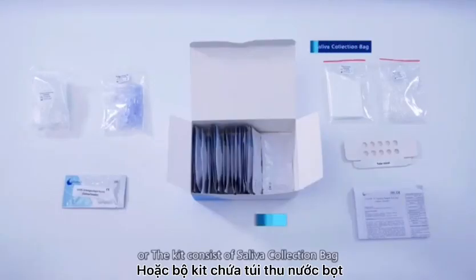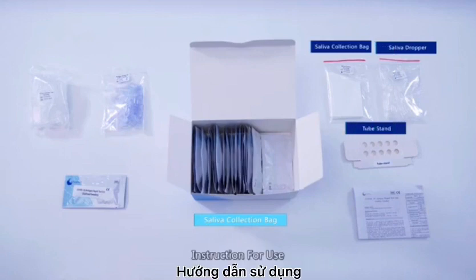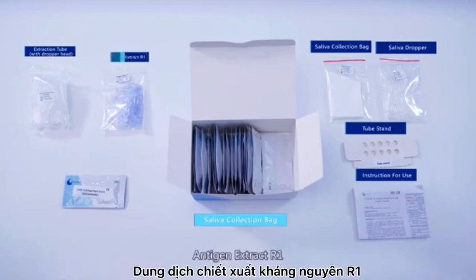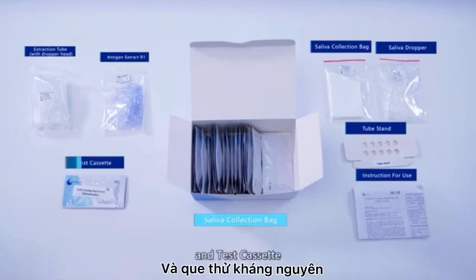Or, the kit consists of saliva collection bag, saliva dropper, tube stand, instruction for use, extraction tube with dropper head, antigen extract R1, and test cassette.